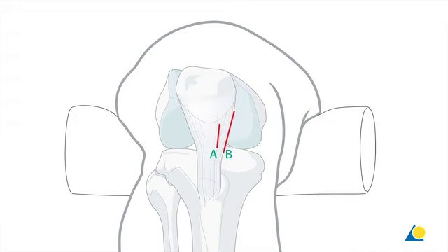B. Proximal tibial shaft fractures tend to develop a valgus deformity if the nail entry site is placed too medially. A more laterally placed skin incision may be needed to avoid this problem.